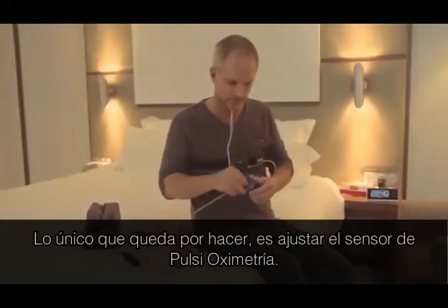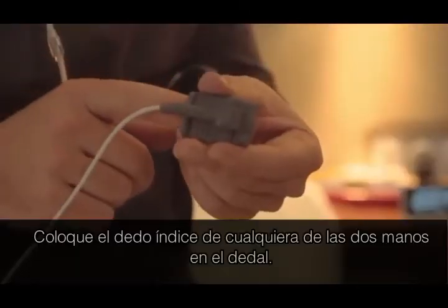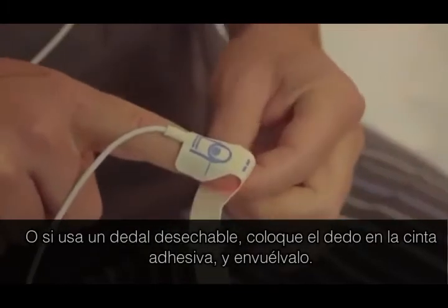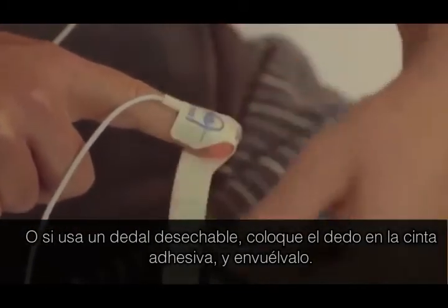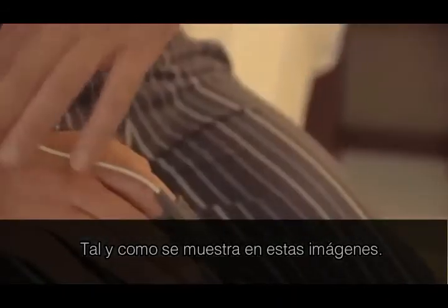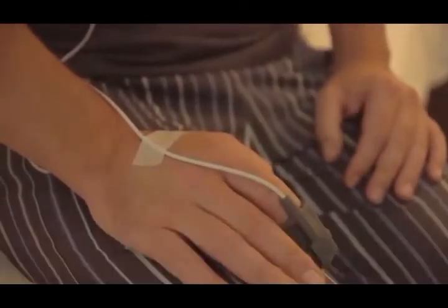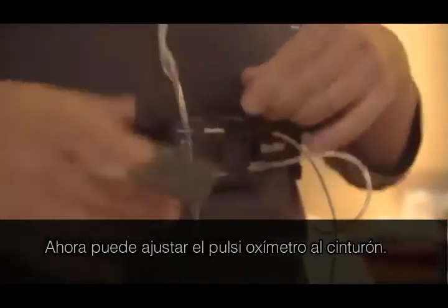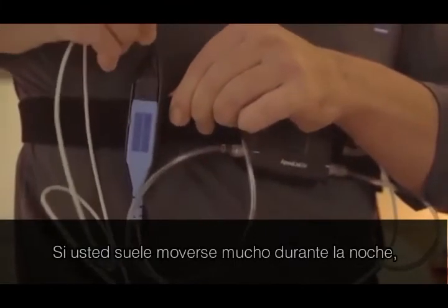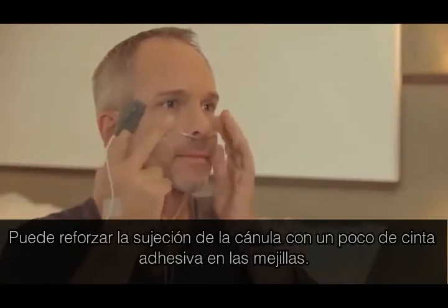The one remaining task is to attach the pulse oximeter device. Place the index finger of either hand in the sensor or, if you're using a disposable sensor, on the adhesive and wrap it around your finger, as shown here. Secure the line using the tape supplied. Now you can attach the oximeter to the belt alongside the ApneaLink Air Recorder. If you're an active sleeper, you can also tape the nasal cannula tube to your cheeks.